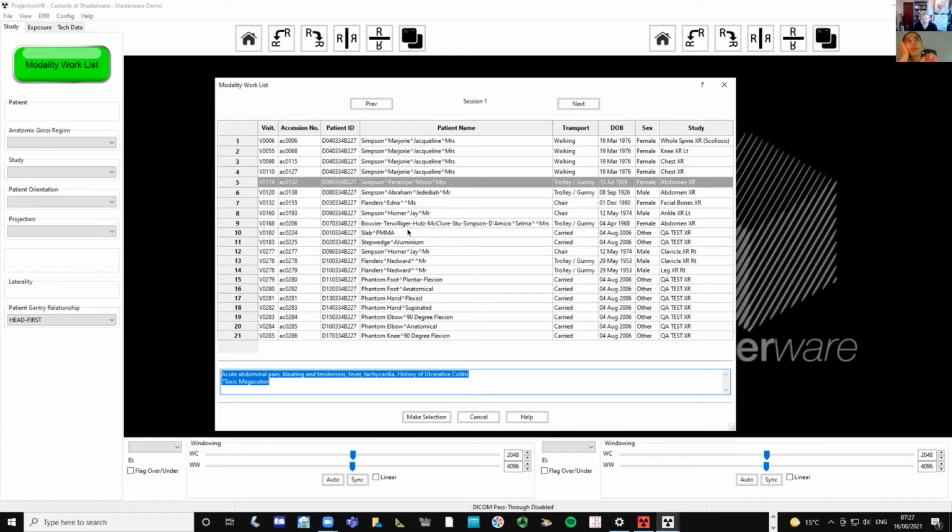Because what I'm after, upon checking this part, the first part was more on the third level, but this part just came into my mind that this can also be useful for our clinical students. We're planning on having our clinical education virtually. At some point, when I see this, I realized that we might make use of this as part of our clinical education.